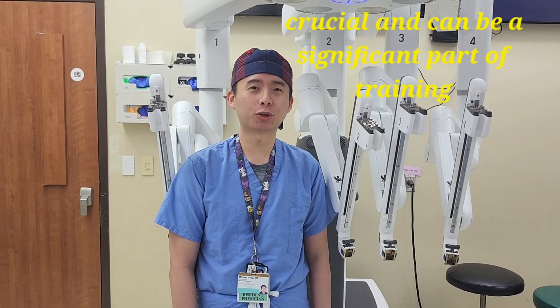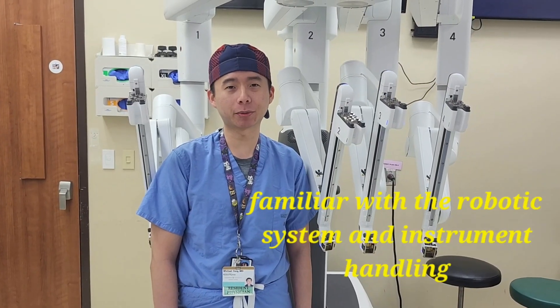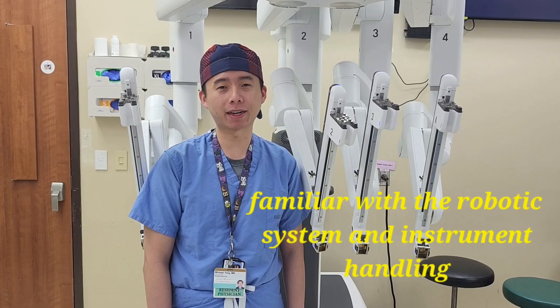Residence Bedside Systems: Fushio and Nutrain. Becoming well-versed with the bedside system allows residents to become familiar with the robotic system, instrument handling, and overall workflow during the robotic case.